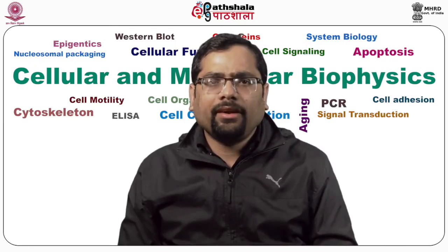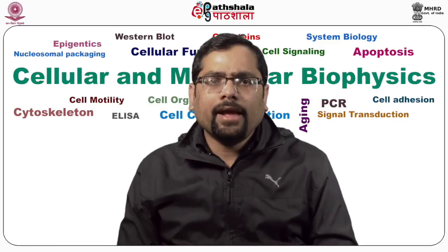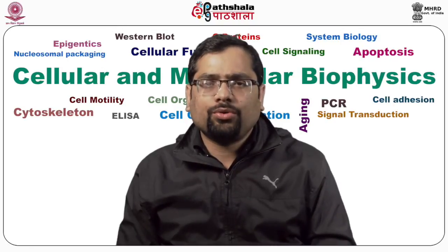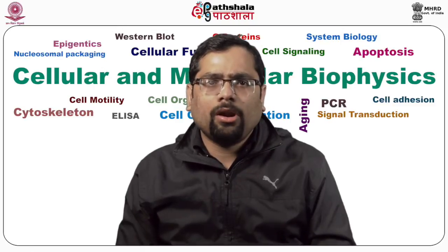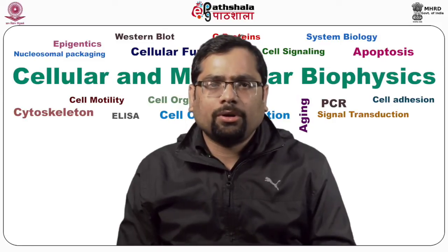Continuing with the principle of FNIRS, the increased oxygen transport that is due to the neurovascular coupling to the area typically exceeds the local neuronal rate of oxygen utilization. So, whatever oxygen is being utilized at the tissue, there is more oxygen transported to the particular tissue due to that neurovascular coupling. It results in an overabundance of the cerebral blood oxygenation in the active area. So, we will find more oxygen in that particular area.